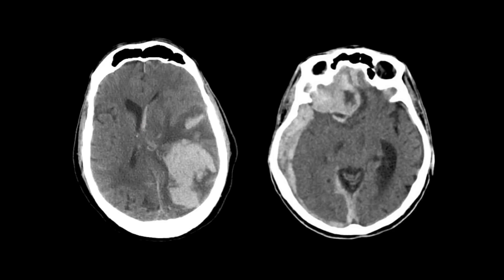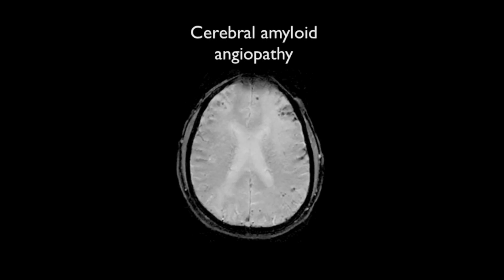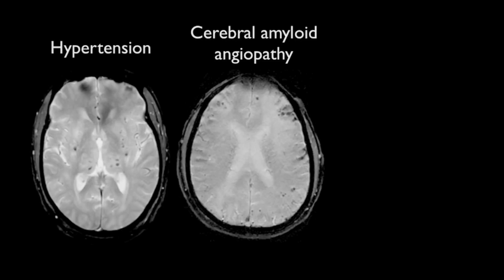The distribution of lobar hemorrhages is due to the distribution of the underlying pathology, namely that of cerebral amyloid angiopathy. This is seen on T2 star weighted or susceptibility weighted MRI images as multiple foci of signal loss scattered peripherally through the cerebral hemispheres. This is in contrast to chronic hypertensive micro-hemorrhages, which are clustered in the basal ganglia, pons, and cerebellar hemispheres, matching the distribution of hypertensive hemorrhages.